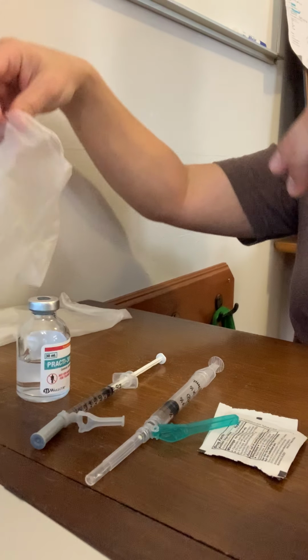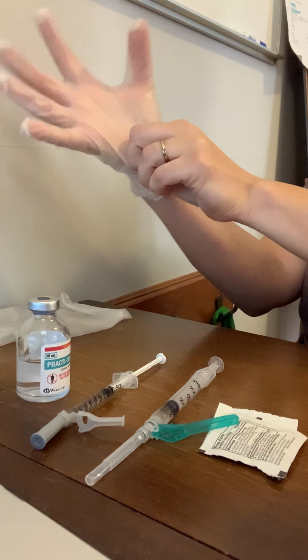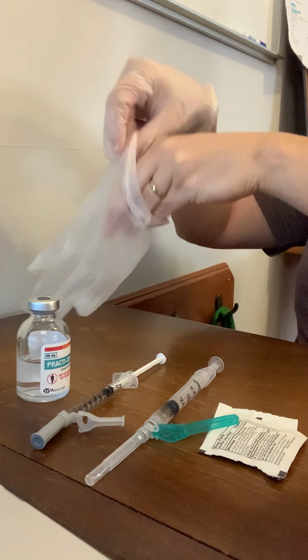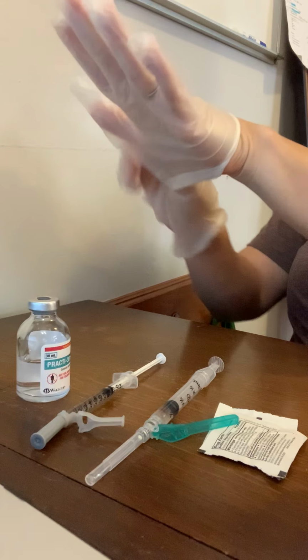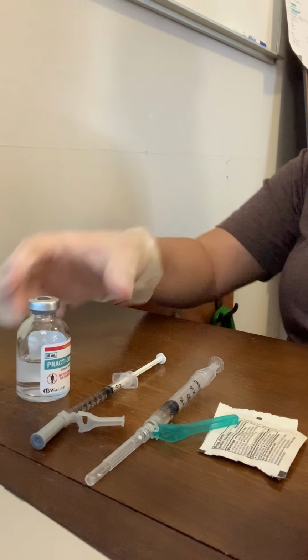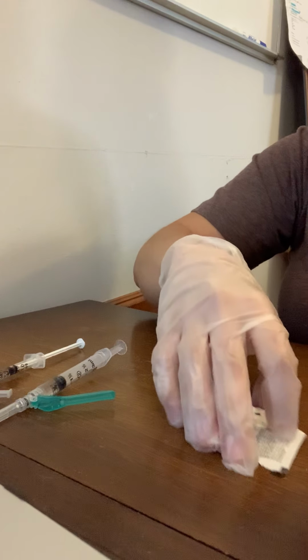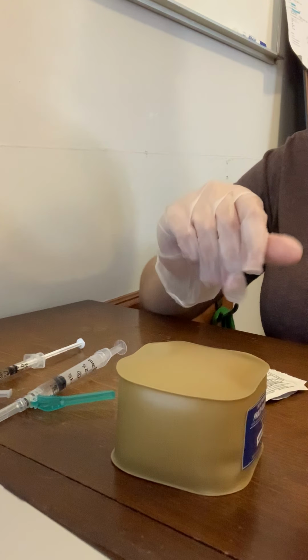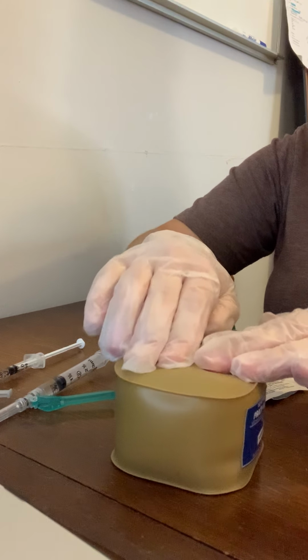All right, so I am going to put on my clean gloves. And I'm going to assist the patient into a comfortable position. All right. I am going to inspect and palpate for bruises.